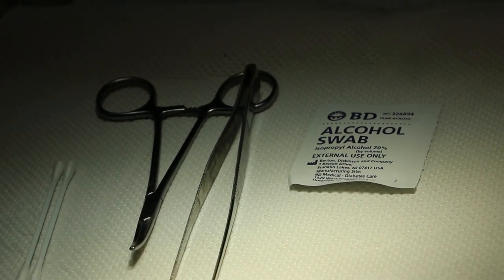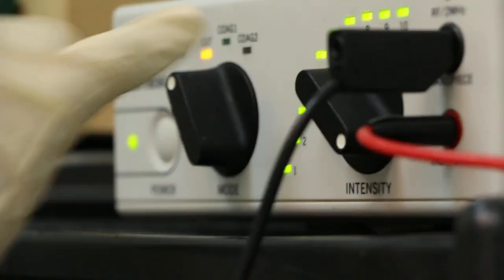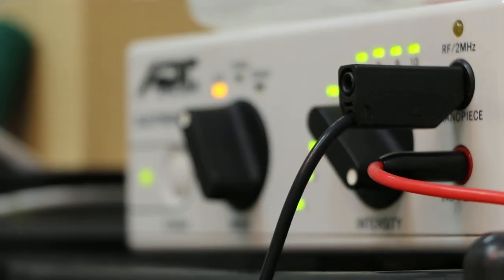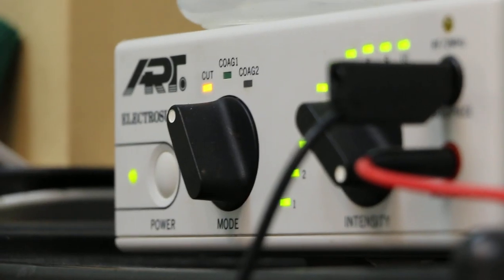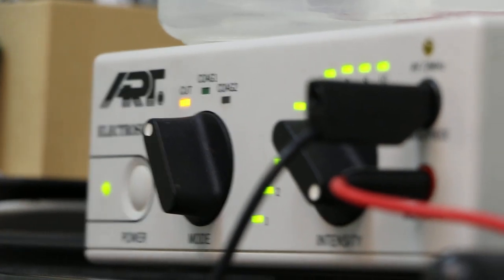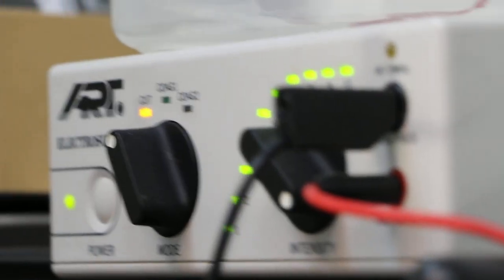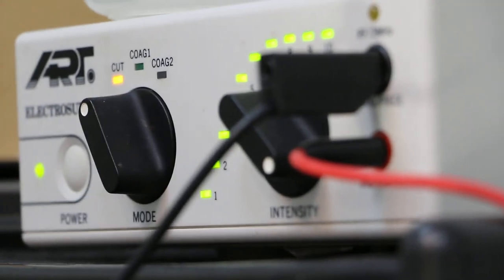This is the electrosurgery, switch on. Put the cut. Cut normally, we put maximum power actually. It all depends. So that is the preparation. We look at electrosurgery here.